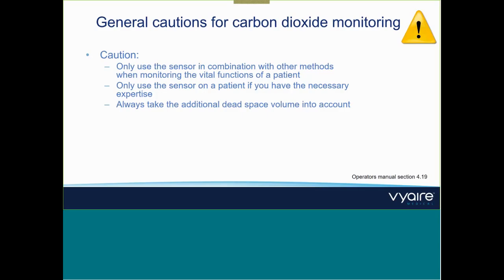Also, on the Sidestream capnography, this shouldn't be done with anesthetic gases, mainly the mainstream and also the Sidestream. They are not prepared for anesthetic gases. So this is also very important when using, for example, something like the Anaconda, because with anesthetic gases the infrared units will give you wrong monitoring, and it impairs the whole monitoring and measurement. So with anesthetic gases, you should at least be aware that the CO2 measurement can be impaired.